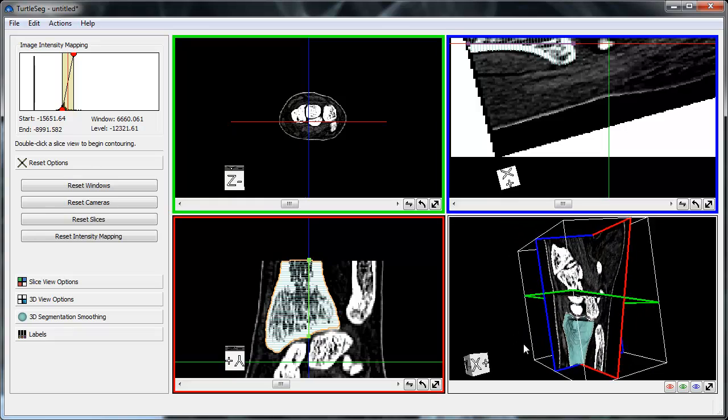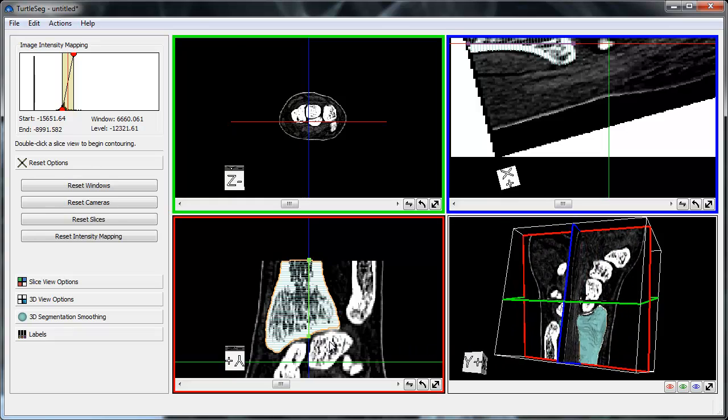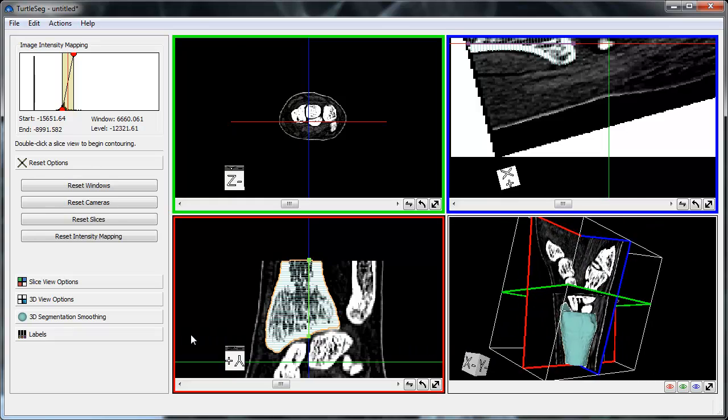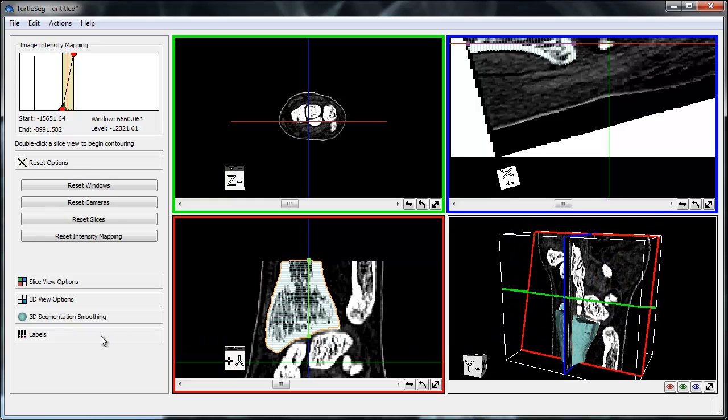In the 3D view, we can see that the resulting 3D segmentation has improved significantly, but it is still far from perfect. In order to improve the segmentation, we iterate over the process of adding a contour and rebuilding the segmentation.